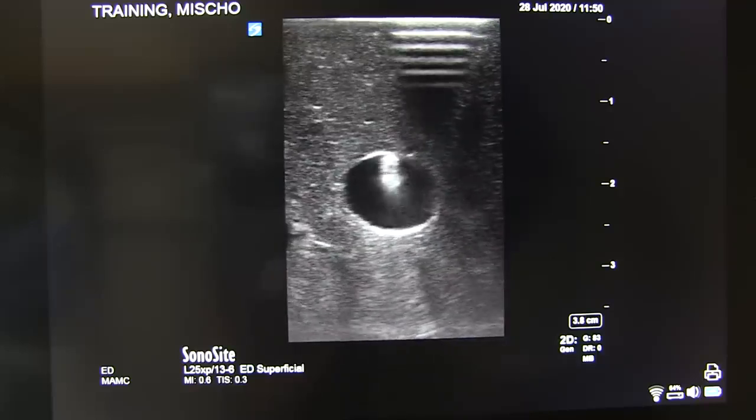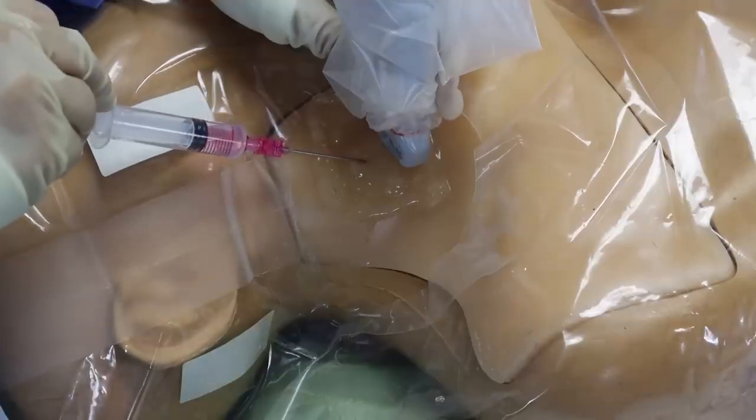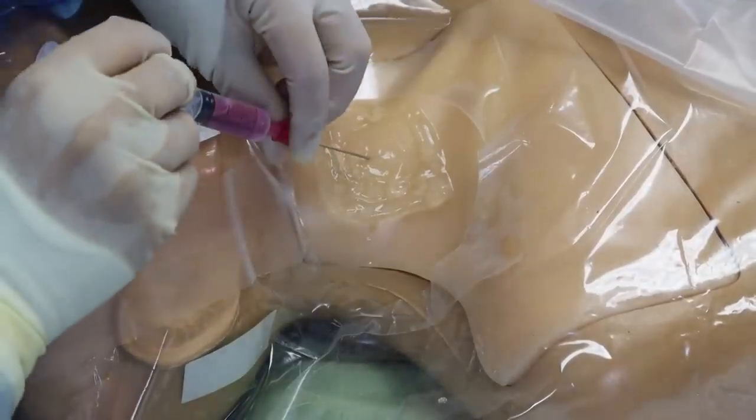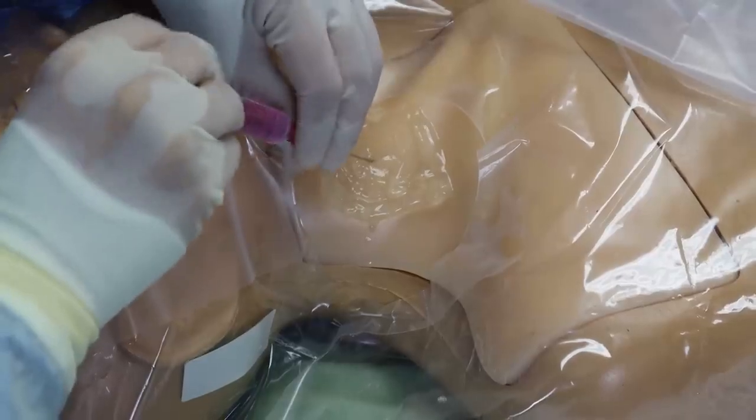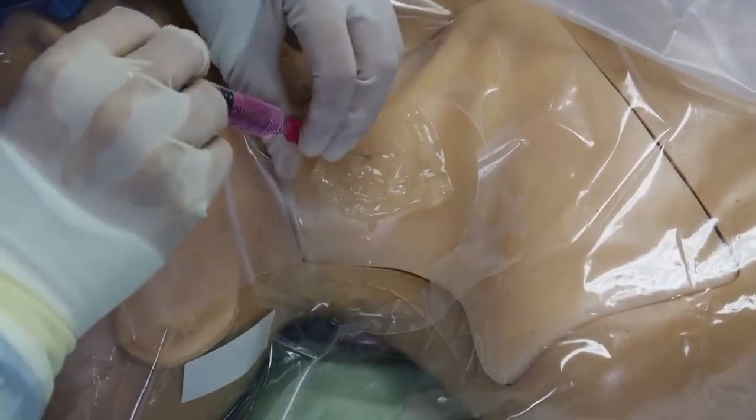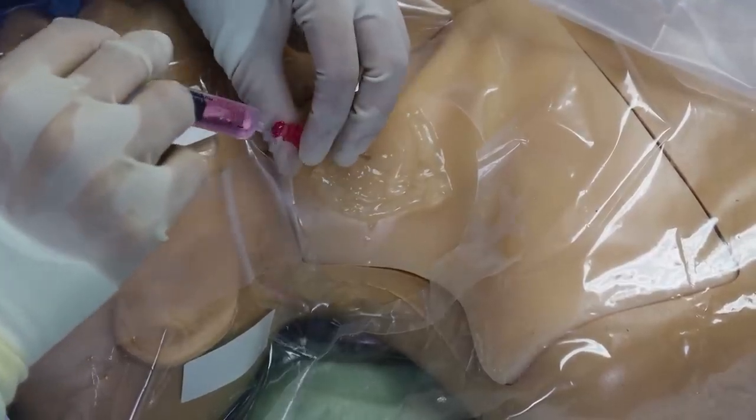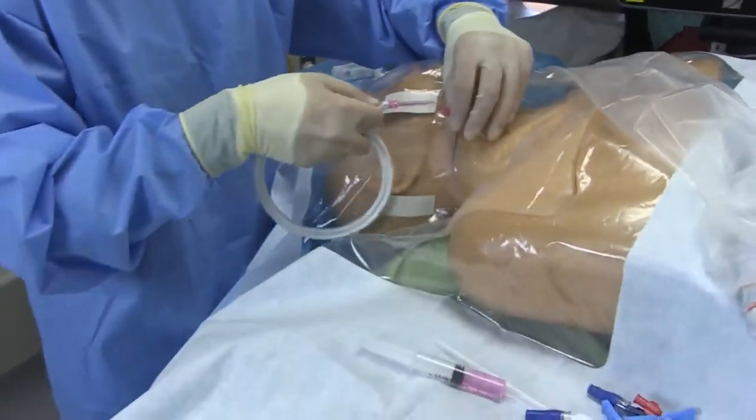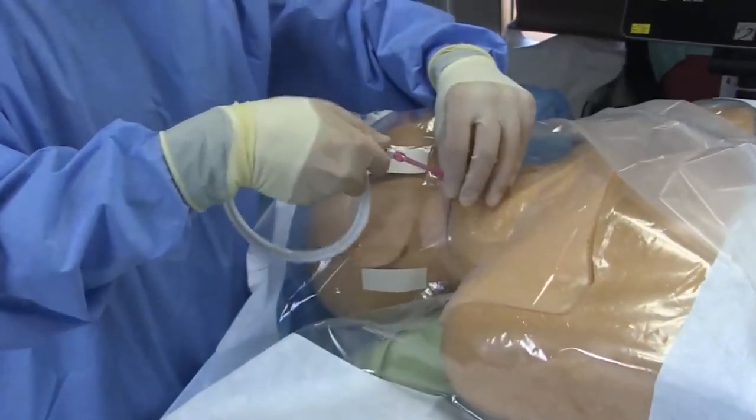Once the needle is in the lumen of the jugular and you are able to draw back venous blood, very carefully remove the syringe from the finder needle. Stabilize that needle while you're doing this. Don't let it move. If you're using the compass pressure transducer, you can feed a wire through it so you don't have to remove the syringe.